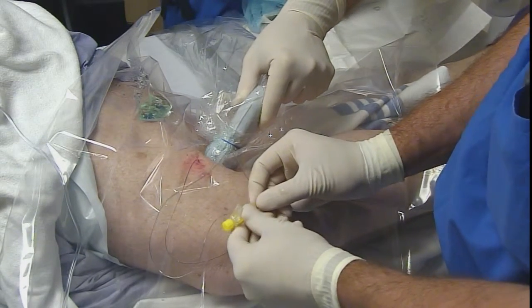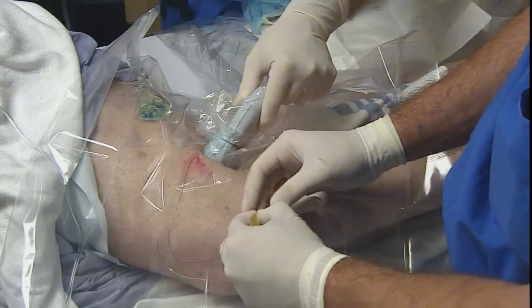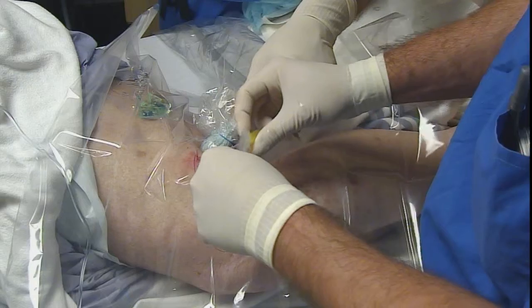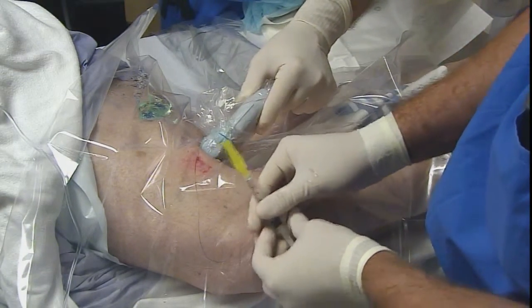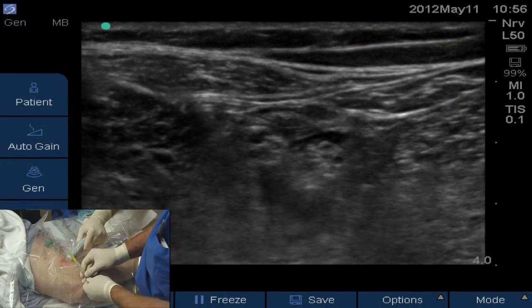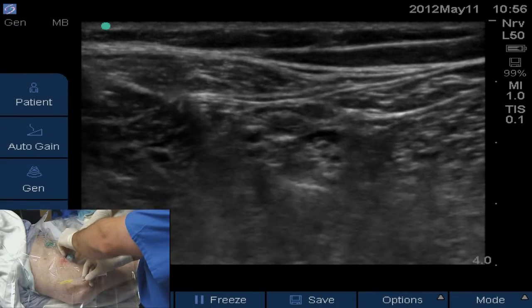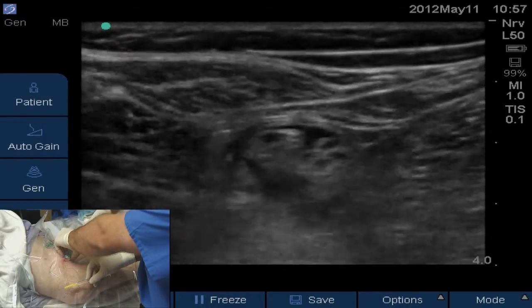Make sure that catheter is all the way hubbed into that alligator clip. With our test syringe — which has 3 cc's of local and a little bit of air — I'm going to initially inject some air through that syringe to highlight the whereabouts of that catheter tip. A little bit of air. You can see the air tracked over the peroneal and under the tibial. We'll scan left and right of that injection of air just to find out where it's most highlighted and most reflective.